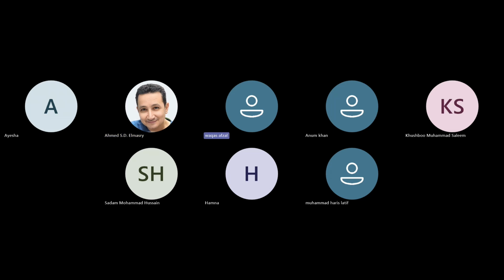But I think there is some role regarding the balloon position also, because most of the time we see there is not a good balloon trace, and we are unable to even adjust the timings. It will affect the augmentation for sure.